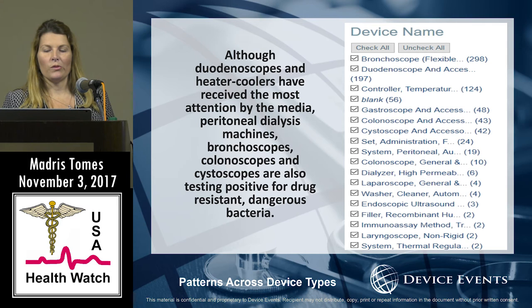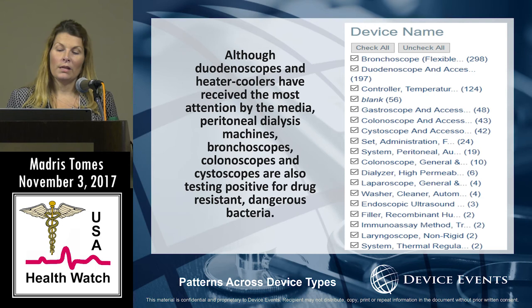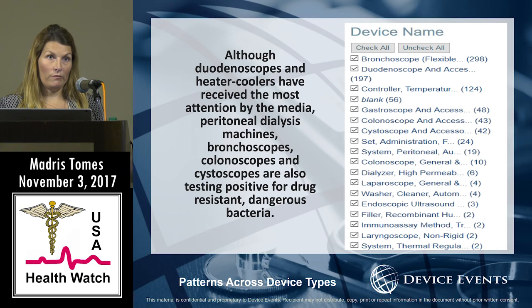There are also peritoneal dialysis machines that are having a lot of superbug issues, colonoscopes, and think of this in this way. If you have a device in your hospital and you have an outbreak, wouldn't you want to know which device was used on you, so that you can trace the patients back to that individual device? If you have 20 of them and you're not tracking that in your EHR, then you're going to have to notify 20 times more people when that problem is identified. And so that's why UDI and claims is becoming kind of important.